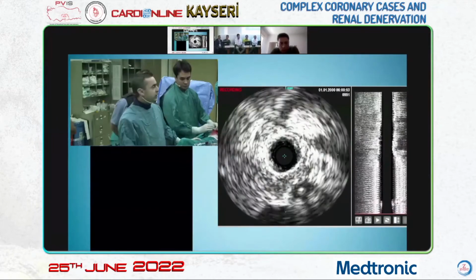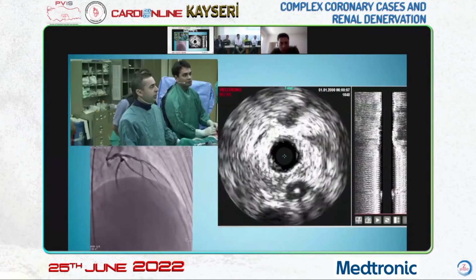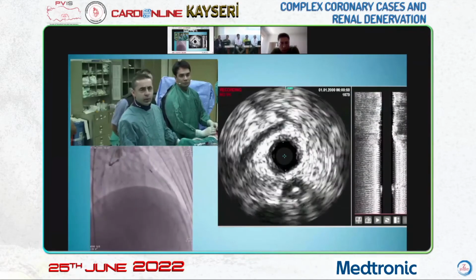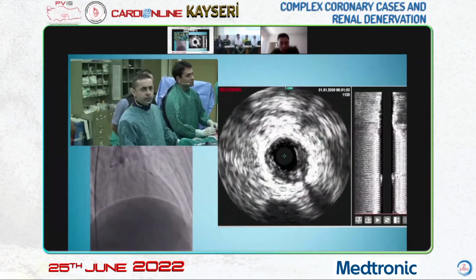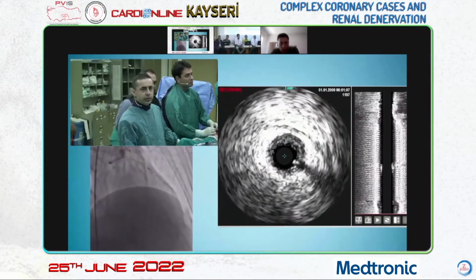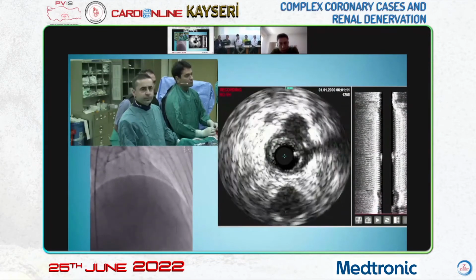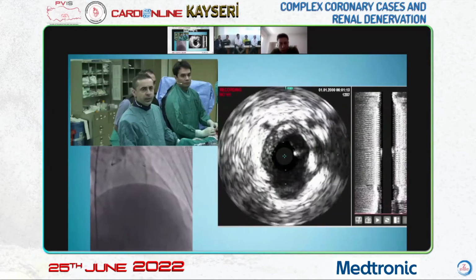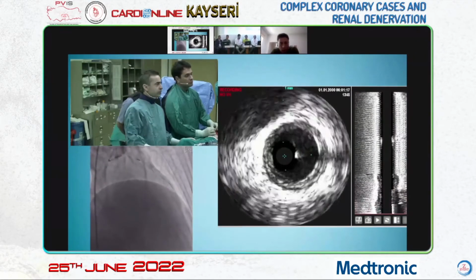You can see the penetration. IVUS can be used for the penetration. Now, there is a pull now. Pull it back slowly. Here, the lumen is good. There's a concentric atherosclerosis. Pull it back. You can see the septals. Stop it.